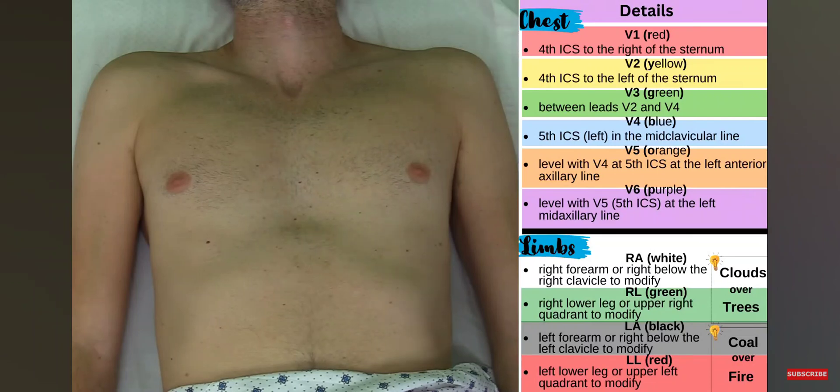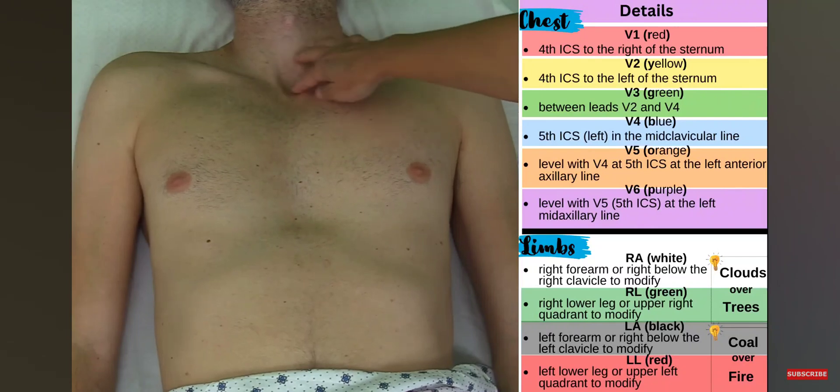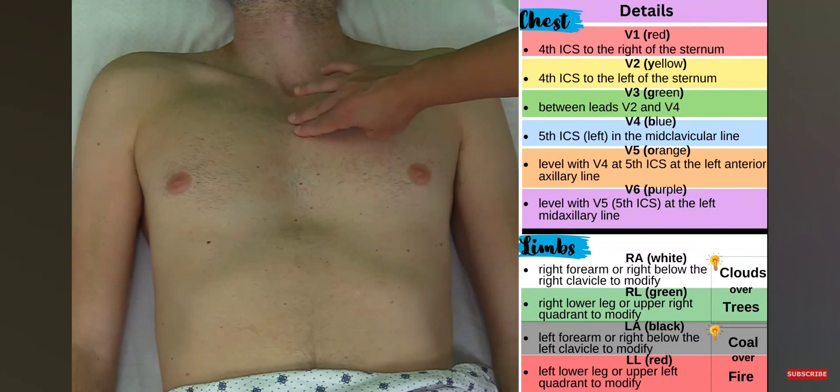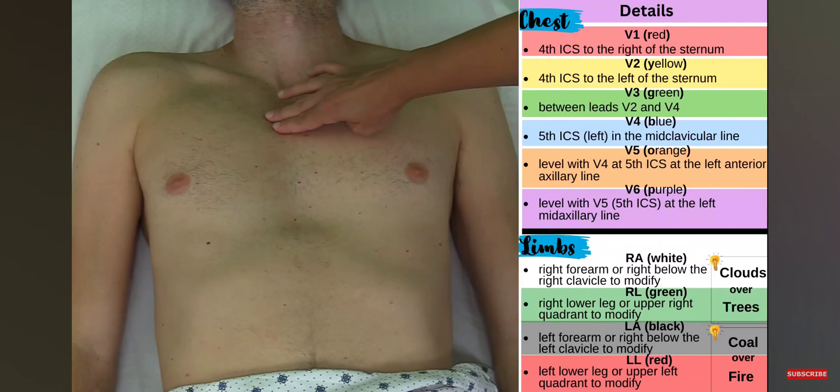Now I'm going to place the precordial — also called the chest — electrodes. To do this I need to use landmarks because my goal is to get to the fourth intercostal space, where V1 and V2 will go. I'll find the suprasternal notch right here — it's a notched-out area in the bone — and travel down a little bit until I come across a hump known as the angle of Lewis, which is like a ridge.